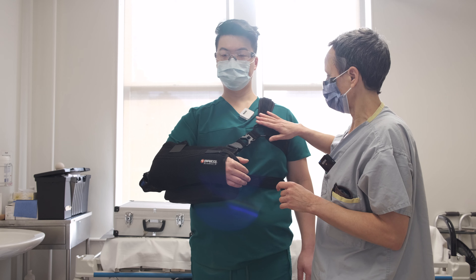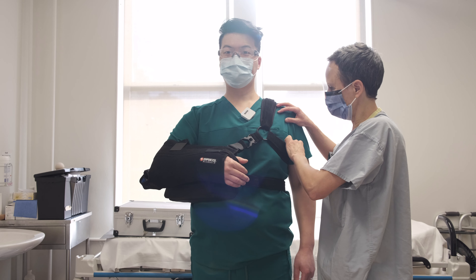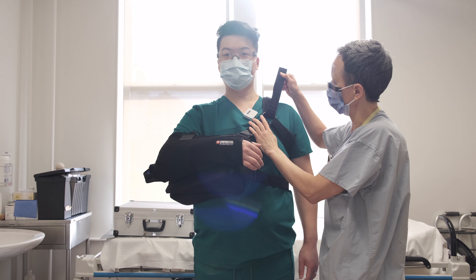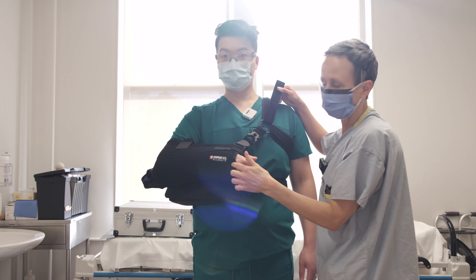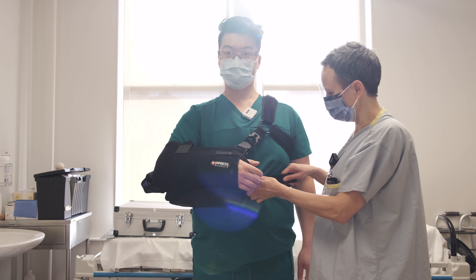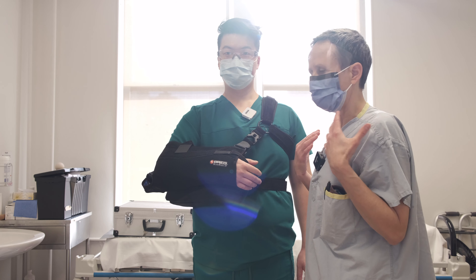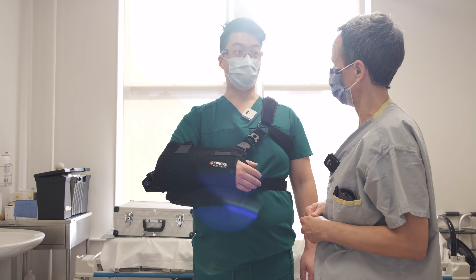For the straps to adjust to height and fit — this one can be pretty loose, that's just so it's not sliding up to your neck. But if I adjust these velcros and pull, you can see it lifts the arm a little bit further up or a little further down. We always aim for the elbow to be at a 90-degree angle. Same thing with the belly strap — you want to feel secure, but it shouldn't be too tight or too loose. When you're in the sling and totally relaxed, you should feel your shoulder is fully supported.